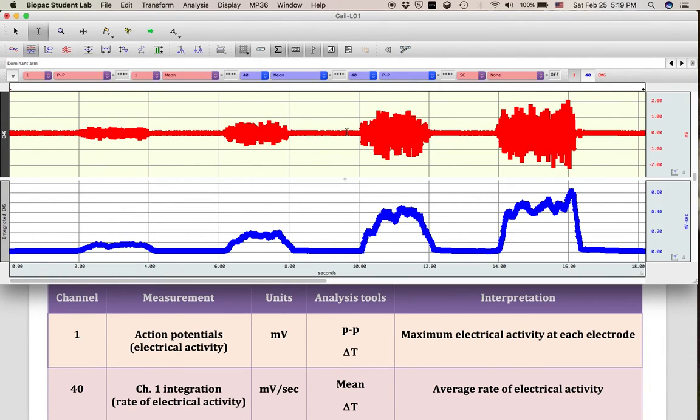When analyzing raw data from an electromyogram, we're always going to use the peak-to-peak analysis tool. If I highlight one clench effort, notice that my peak-to-peak is 2.82 millivolts.